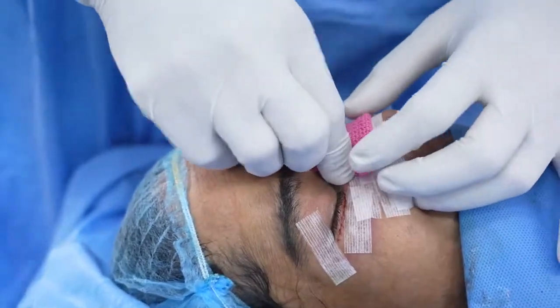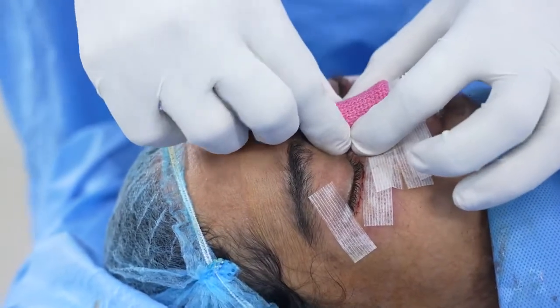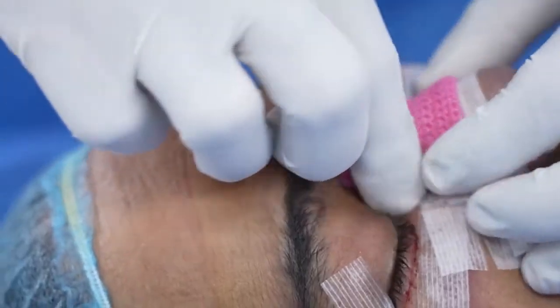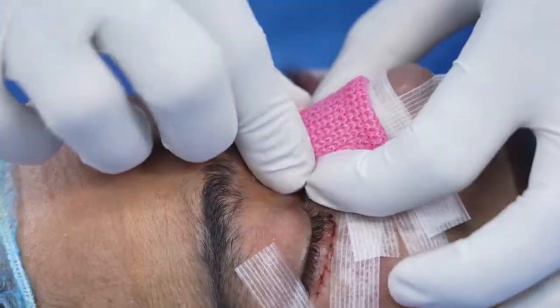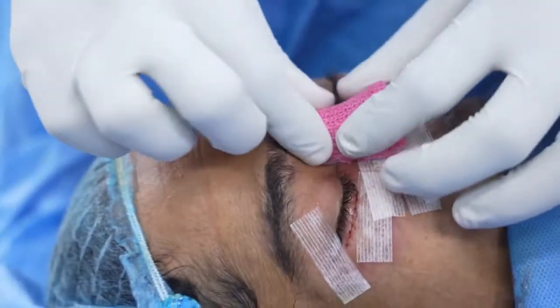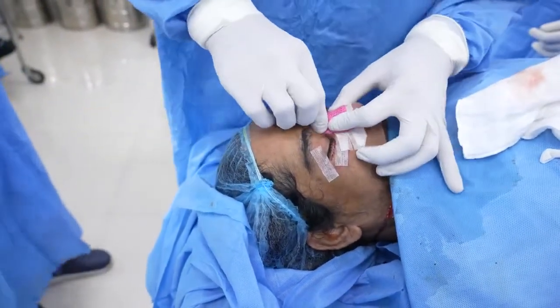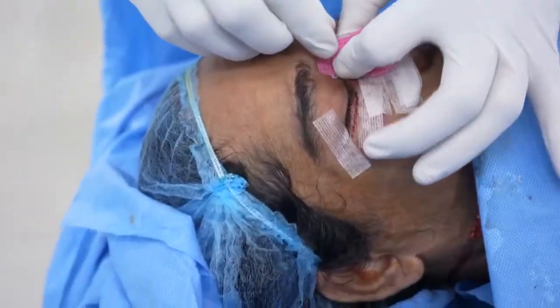I did mention to you that we did an osteotomy for this patient, so I would need to adapt it in such a way that the nasal base that we've osteotomized and moved inside stays that way. This is kept for about a week, sometimes a little bit longer. So you can see the splint getting adapted nicely.